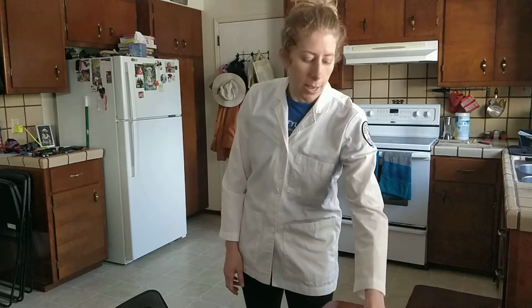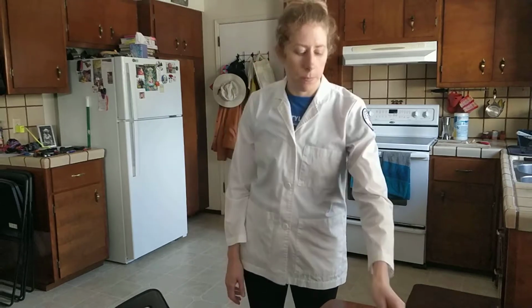This is for IV push. I'm not going to do medication reconstitution since I submitted that in a different video. And also I'm going to just pretend to use the alcohol wipes as I'm running a little bit low.